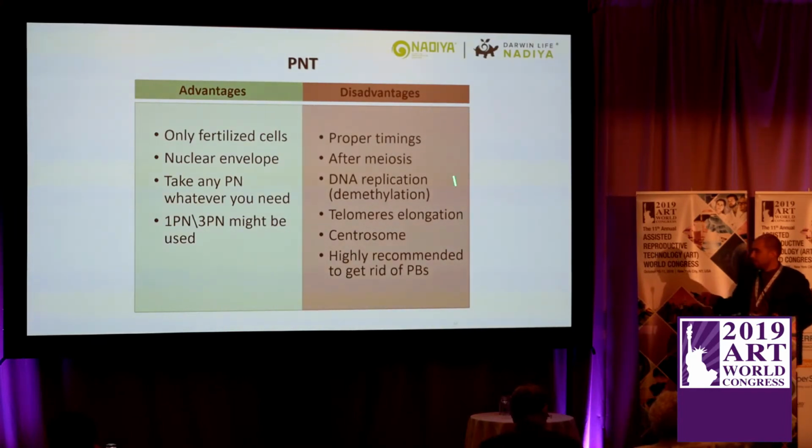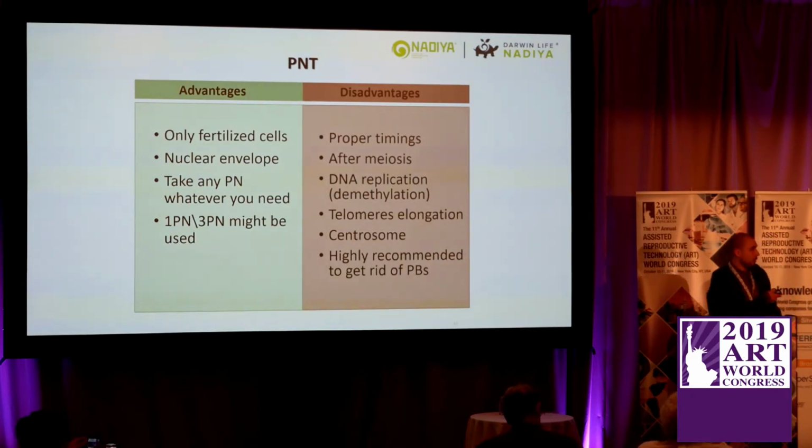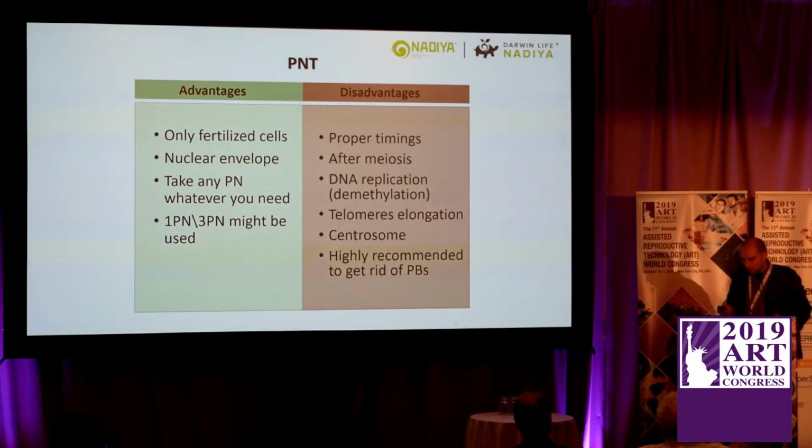But there are a lot of questions that we don't have an answer to. How does this procedure impact the processes that occur inside the pronuclei? We don't know, but apparently we have 10 children and they're healthy, so probably there is no impairment in this, but who knows? We just don't know.